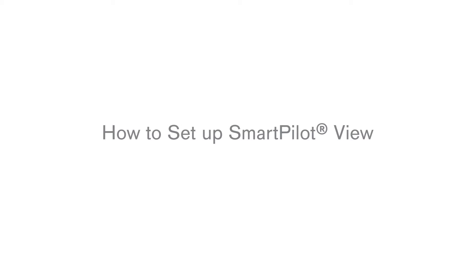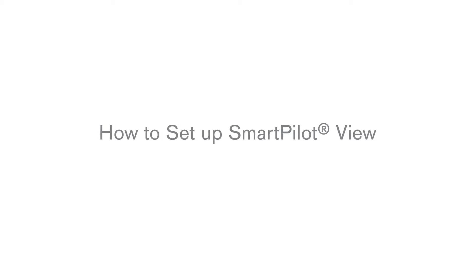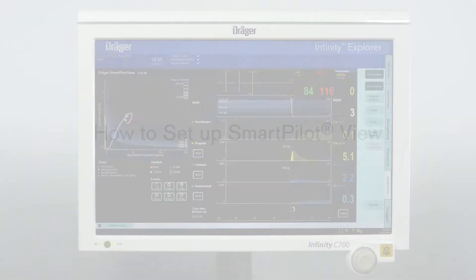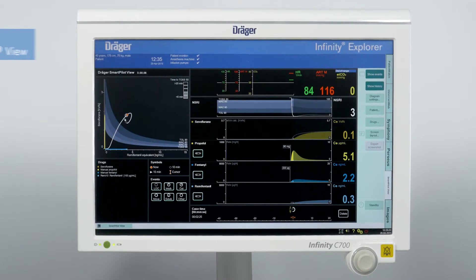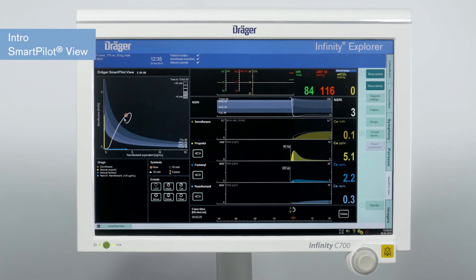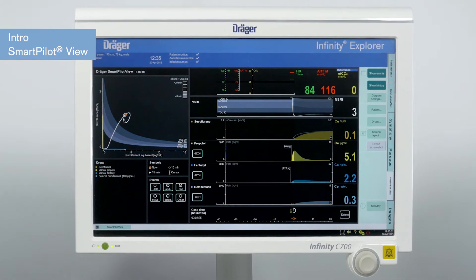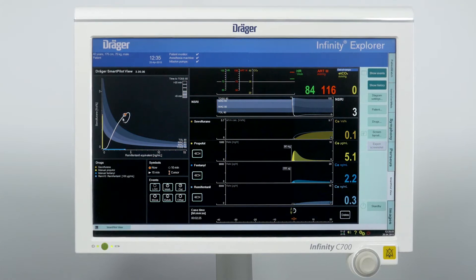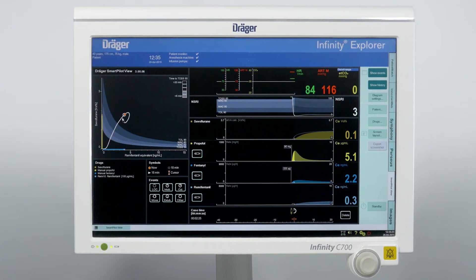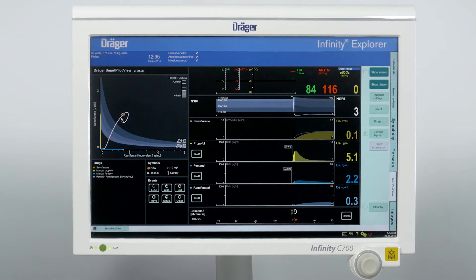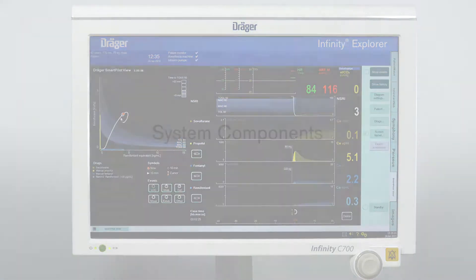In this episode, we will show you how to set up SmartPilotView system components, connections, ports and cables. SmartPilotView is a software for visualizing drug interaction during anesthesia with pharmacokinetic and pharmacodynamic models via an easy to understand display.